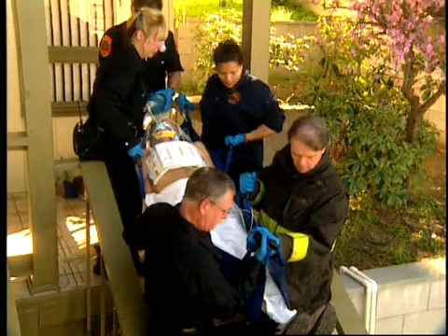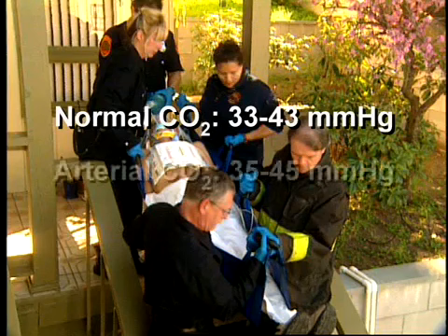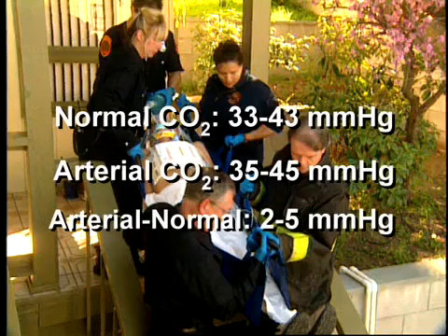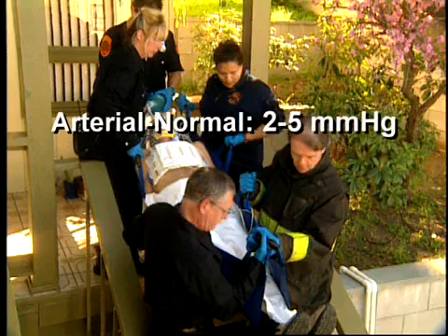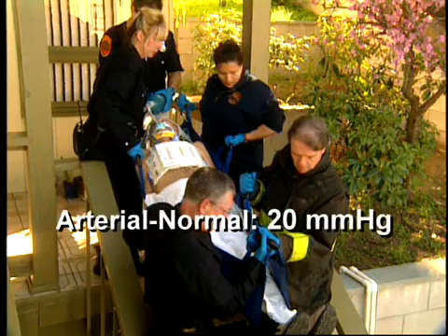A normal CO2 is between 33 and 43 millimeters of mercury, and normal arterial CO2 is 35 to 45 millimeters of mercury. The difference between the normal arterial CO2 and the end-tidal CO2 is 2 to 5 millimeters of mercury in a healthy person with normal ventilation and perfusion. This difference increases with low and high ventilation and perfusion. In the patient with poor cardiac output, this will drop to below 20 millimeters of mercury.